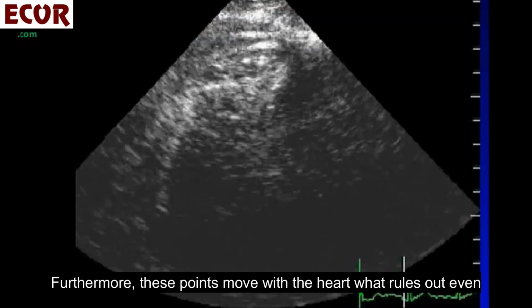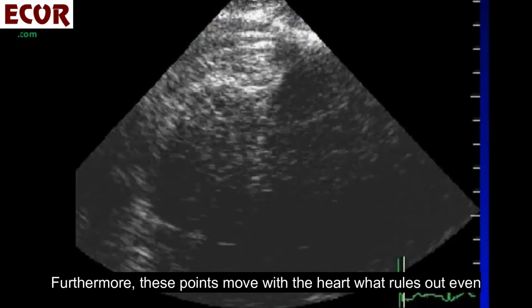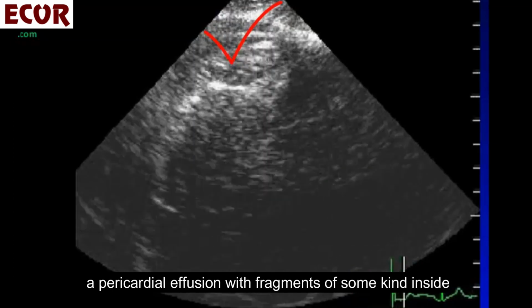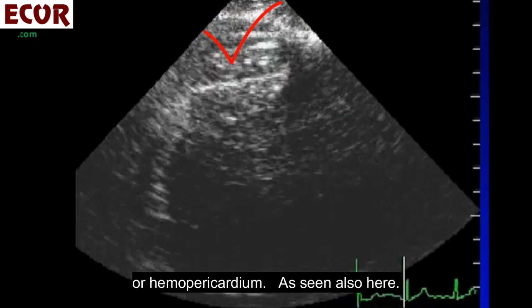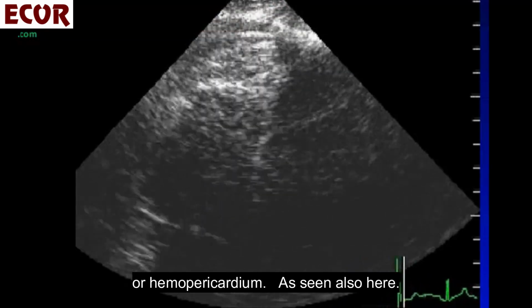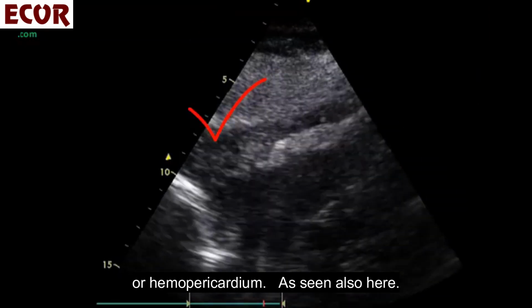Furthermore, these points move with the heart, which rules out even a pericardial effusion with fragments of some kind inside, or hemopericardium, as seen also here.